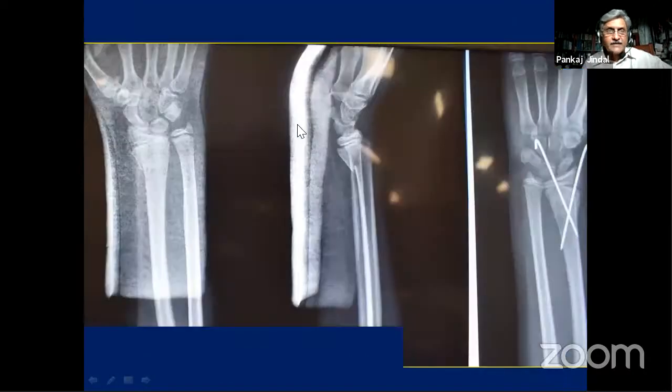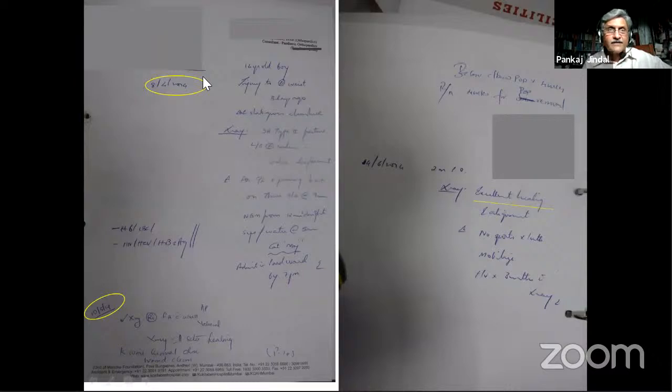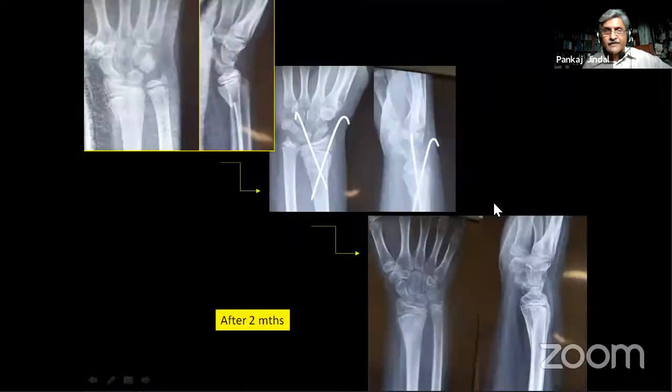and this was a fracture. It has been fixed with K wires here. This was with a pediatric orthopedic surgeon to start with, and he has been adequately followed, and it was concluded from the X-ray after the healing that there was excellent recovery here.